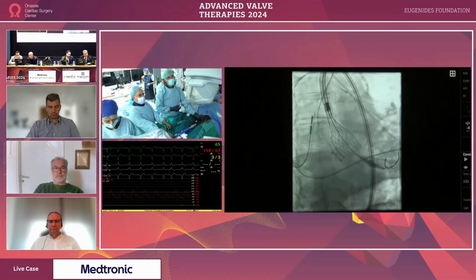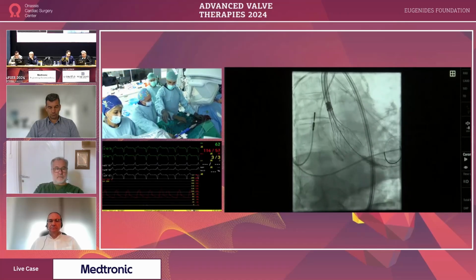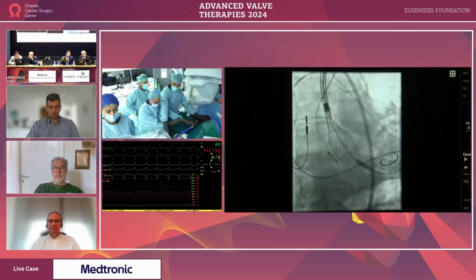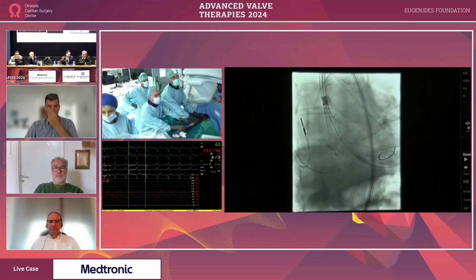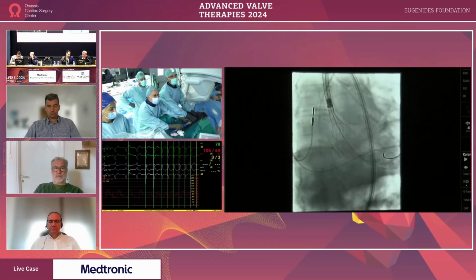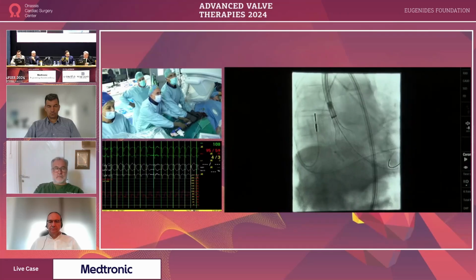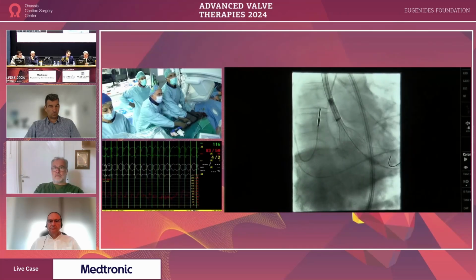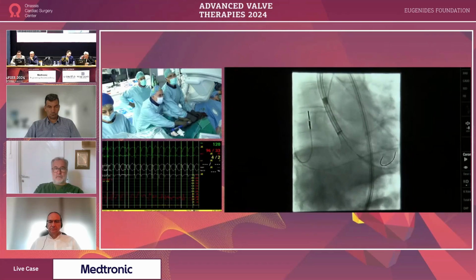The patient has a permanent pacemaker, and unless she is on the truly upper border of the size, which she is not, why won't you implant it like 3 millimeters deeper? Yes, we'll try to do that. Don't you agree? I fully agree. The patient had a pacemaker, and there is no need to do a full cusp overlap technique in this patient.